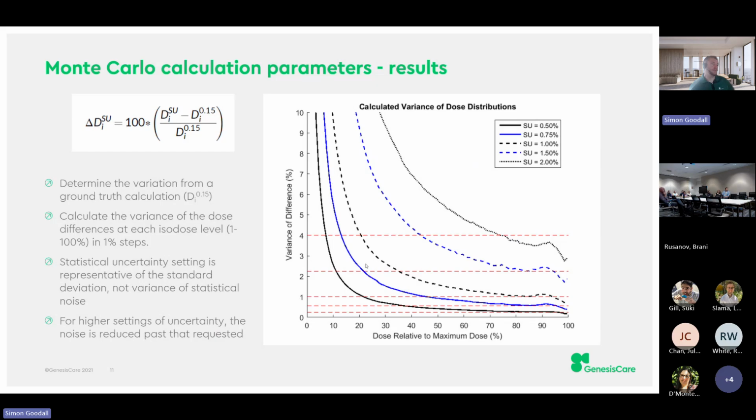But as we come lower down to these low isodose calculation areas, we start to see increased variance, which comes back to the way this is implemented: the histories obviously predominantly go through the PTVs and targets, and the lower doses and the OARs outside of the field have less history simulated through them, which gives us a greater uncertainty in the calculation. So this is generally quite good for radiotherapy, but it does mean that we need to consider this in cases like spine or SBRT, where we might have a high calculation precision inside the targets, but OAR doses that can be in this 30 to 40%, like the cord, do have almost double the uncertainty in them.